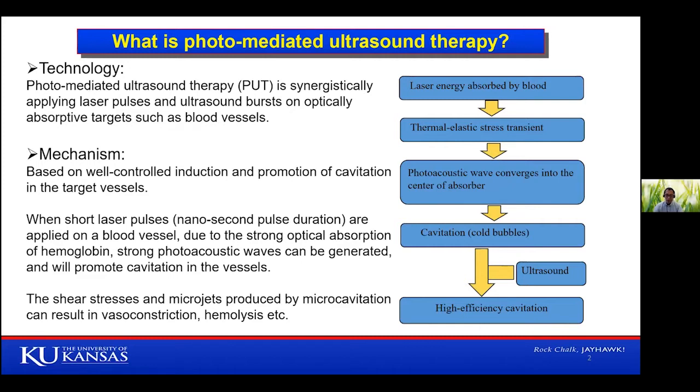And of course, at the same time we apply an ultrasound burst. Ultrasound itself also has a negative pressure, so the two negative pressures add up together and enhance the cavitation effect. When the cavitation effect is enhanced, the shear stress and micro jets produced by those microbubbles can result in a lot of bioeffects in blood vessels or in some other tissues. This is how we designed this technology.